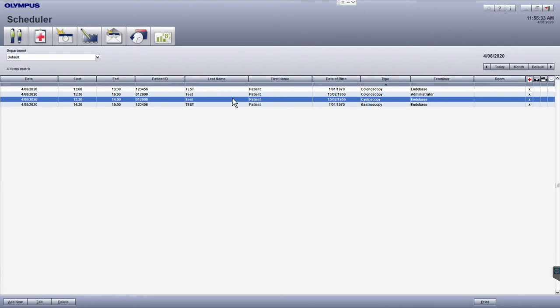Depending on whether your EndoBase system is integrated with your hospital information system, information will be populated here automatically or will need to be added in manually.